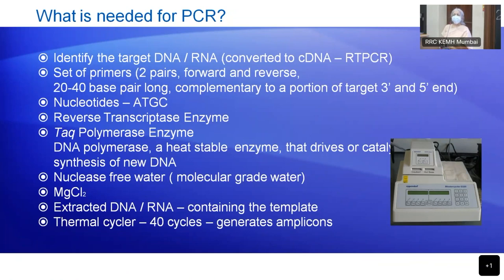Then you need to have, especially in molecular labs, you can't do with distilled water, you need to have a molecular grade water. A molecular grade water is one which will be nuclease free. Why do you not need nucleases? Because they will destroy your nucleic acid, which you are trying to detect. So you need to have nuclease free water.